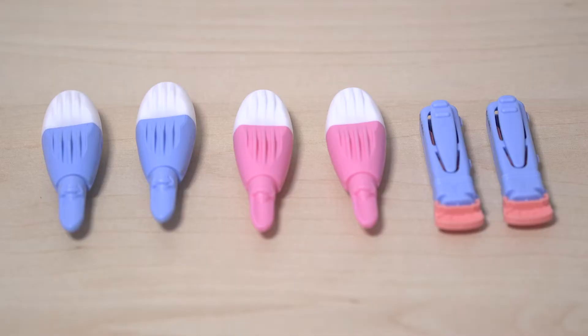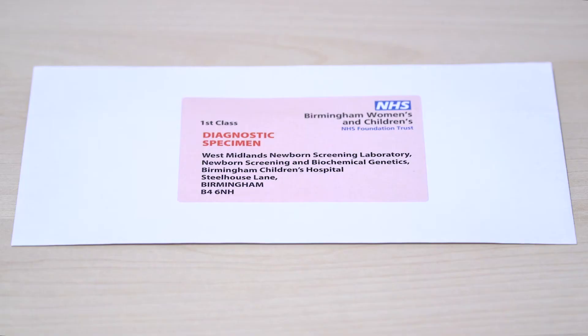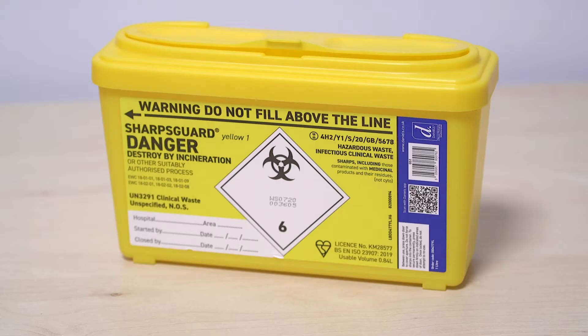Make sure you have your lancets, stabbers, needles — whatever you want to call them — ready. The blood spot card is labelled, the clear envelope it goes into, a self-addressed stamped envelope, an alcohol wipe, cotton wool and plaster if needed, and a sharps bin.